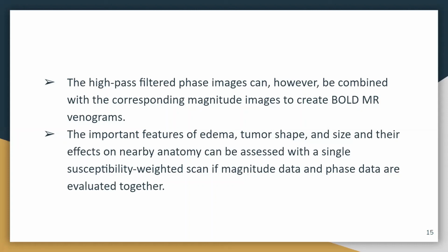So to conclude, we have demonstrated the potential of MR phase imaging and emphasized that susceptibility weighted phase images bear additional information, especially in the phase images, apart from the magnitude image, that is not accessible in the magnitude images alone as well.